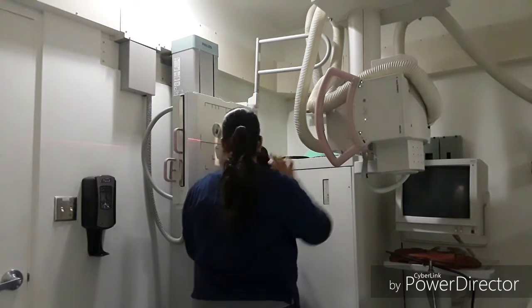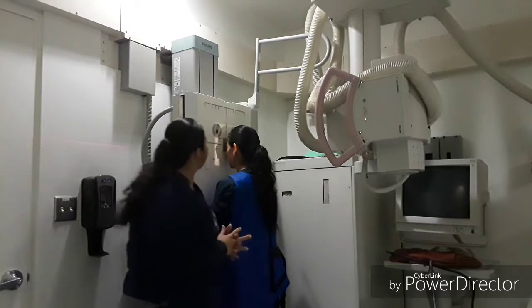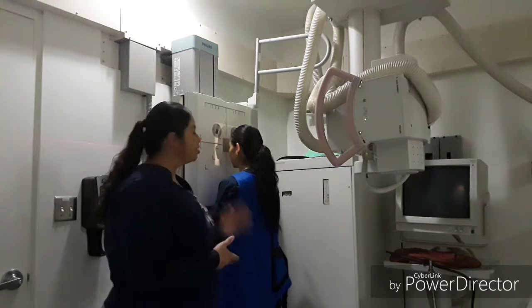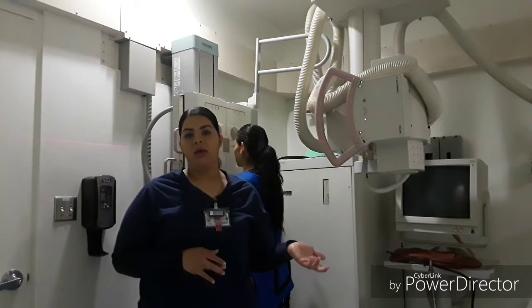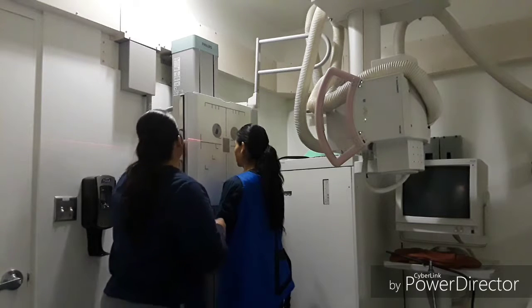Okay, so like that, she should be fine. I will have the patient stop breathing, take my exposure, breathe and relax easy. For this projection, I would do approximately 80 at 20, and then I would move on to my parietoacanthial projection, which is our Waters method.